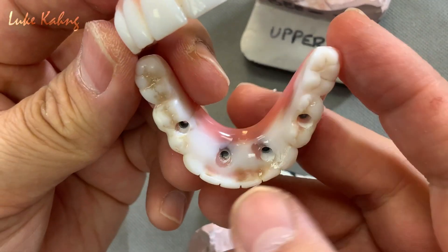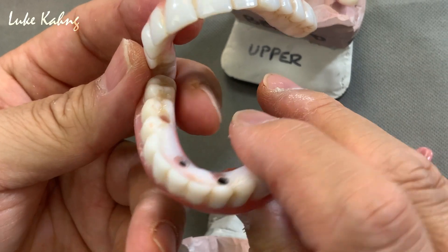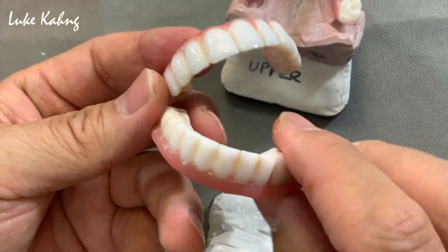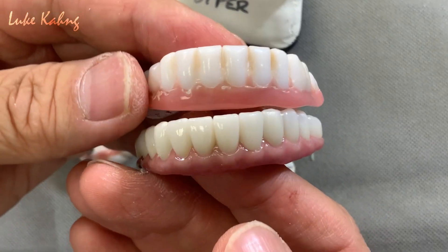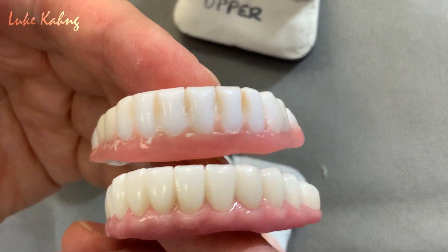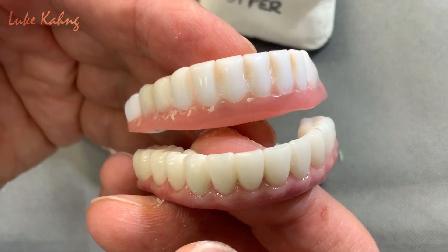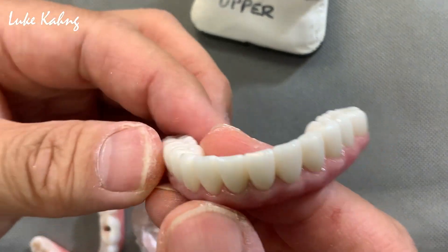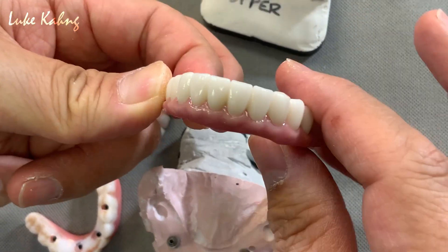The patient wears it a couple of months and then we can see the contour from that. Not only contouring — we check the overall shape of the tooth because we're trying to make the proportion of the teeth. The lateral central is a little bigger and this shape is more longer.